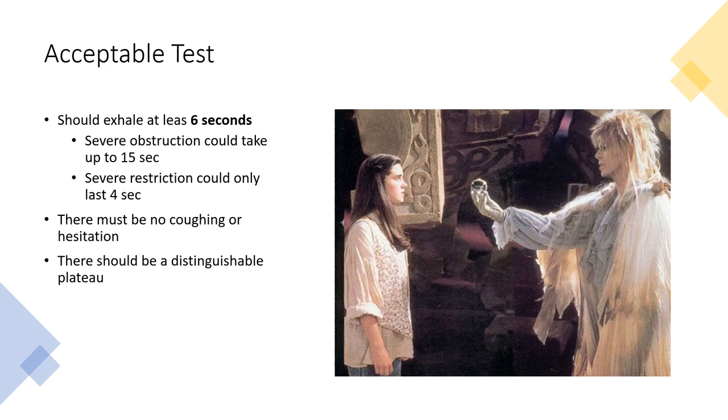What makes a test acceptable? Well, they should exhale for at least 6 seconds. Hopefully you've got all of it out by 6 seconds. And like I said, some patients, like that one example we just went through, maybe take a little more than 6 seconds. Severe obstructive issues can take up to 15 seconds. Same thing with severe restrictions, maybe they only last 4 seconds with the exhalation. So those are issues that you'll see out there as well. But it should be at least, there should be a plateau there.